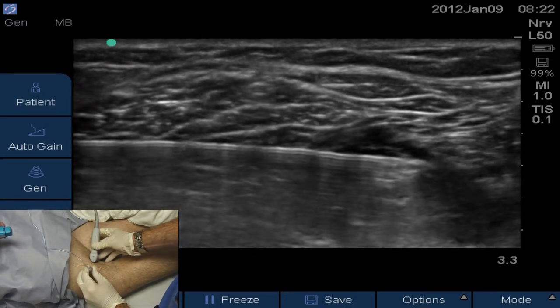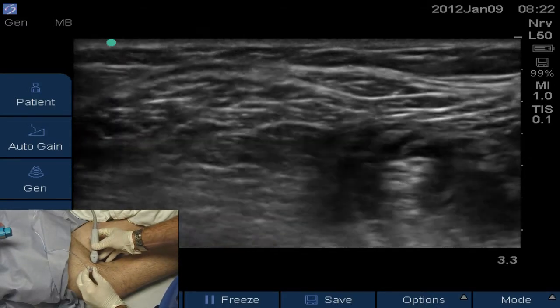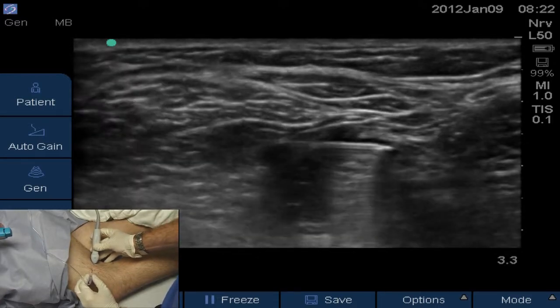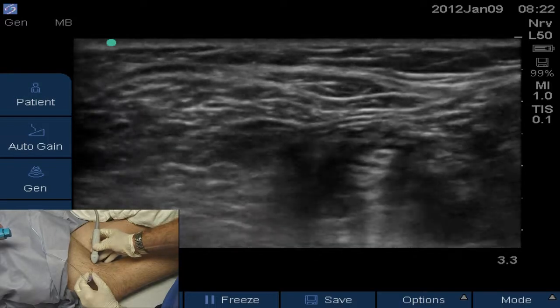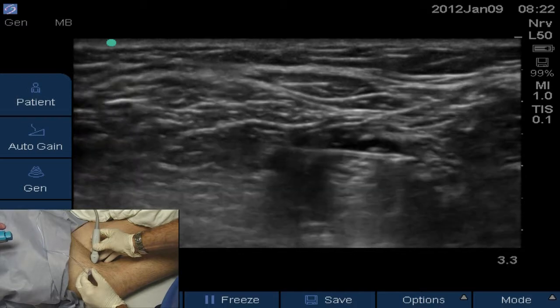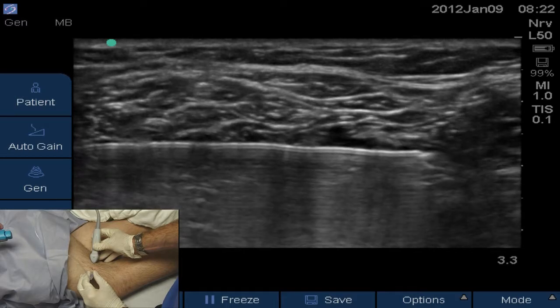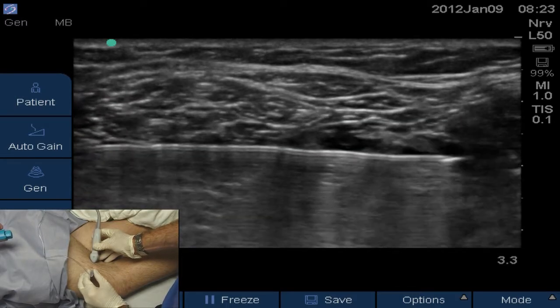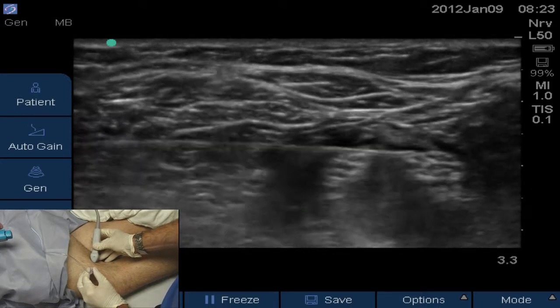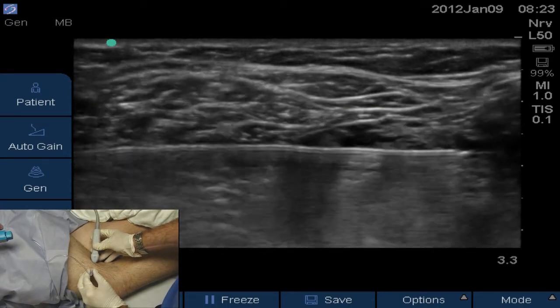I'm going to advance the needle a little bit and get the medial side of peroneal covered. 11 left, so 2cc's more. We're going to do 30cc's total. Peroneal looks pretty well encircled, so I'll flatten the needle a little bit, follow it further, and get the superficial side of tibial infiltrated with 2 more cc's. I'm going to hydrodissect over the top of tibial now — 2 more. He has 5 left — 5cc's left. We'll give the rest at the tibial location. Aspirate and give the last 5cc's.